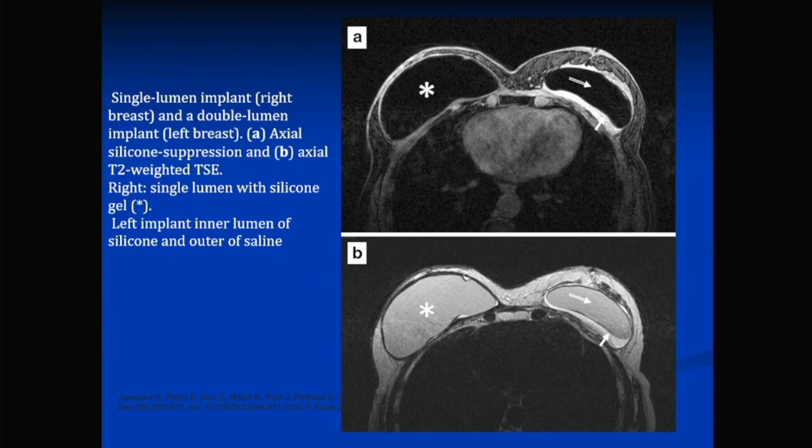To show what a single implant looks like: you can see a single implant clearly on MRI. There are silicone-suppressed images where you suppress the silicone so it appears dark. In one breast you can see a silicone implant with saline around it — a double lumen implant — and you can actually see the difference between the right and left on this MRI image.